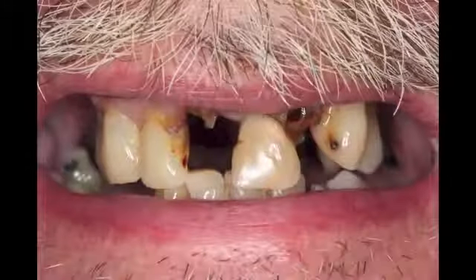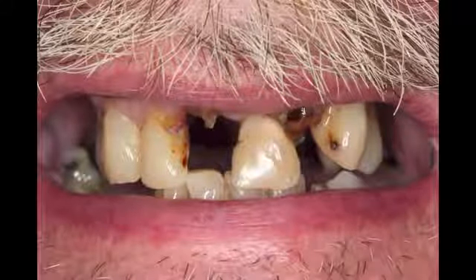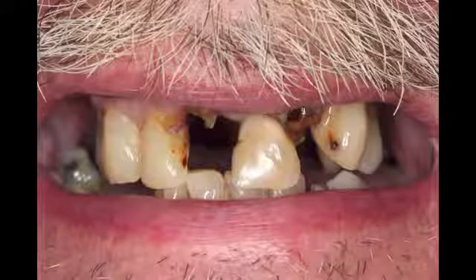So we're going to do step-by-step demonstrations, and hopefully you'll be able to refresh your memory by reviewing this DVD frequently when you're doing a procedure, and try to give you techniques that are incredibly predictable. So here our patient presents with obviously grossly decayed teeth, a quality of life that's been diminished. So we have a plan to strategically remove most of the teeth. I'm going to actually maintain 2 of the maxillary teeth to hold a removable appliance.